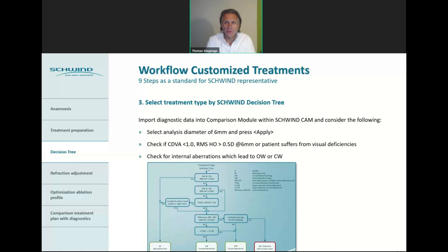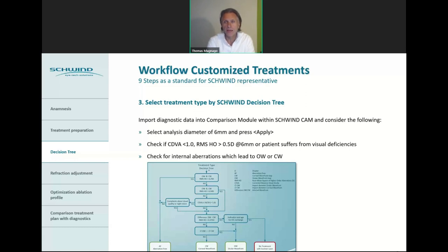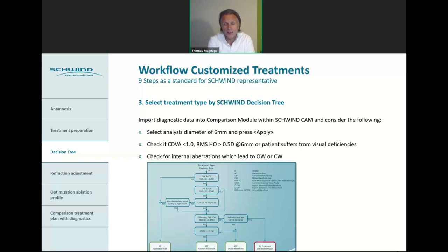Now we are in a very crucial step — the selection of the treatment type with help of the decision tree. As a user with our device, you can load the imported diagnostic data in the comparison module with the Schwind-CAM. You can select the 6 mm zone and press apply to get all the values, then check the corrected distance visual acuity, the root mean square of the higher orders, and whether the patient suffers from visual disturbances.